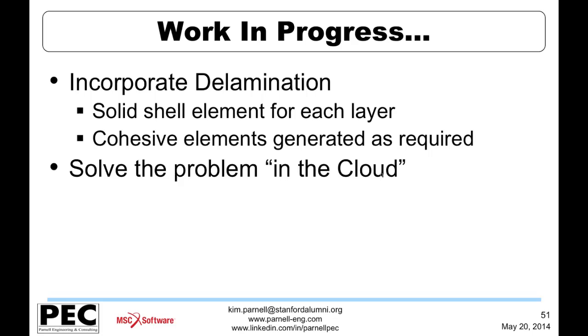And really the best way to do this involves quite a bit of model refinement. If I want to be able to allow for delamination between any layer, basically I'll utilize a solid shell element, one solid shell element for each layer. And then Marc has the ability to generate a cohesive element between the layers, or between the thickness elements, based on meeting a criteria like a normal stress, shear stress type of criteria. It can generate cohesive elements between. So this is a good capability to allow evaluation.